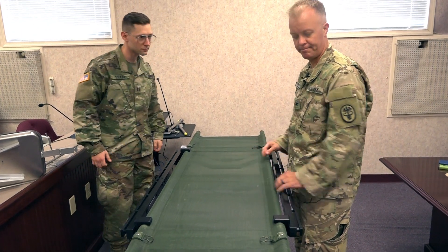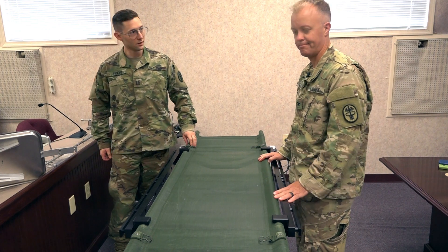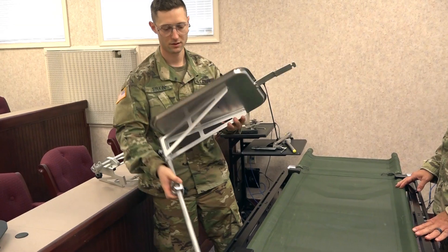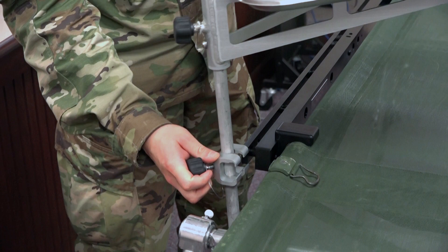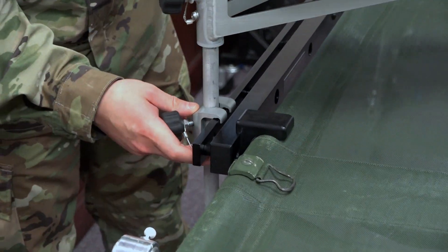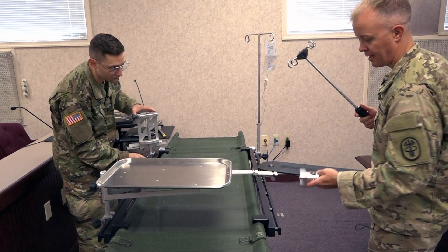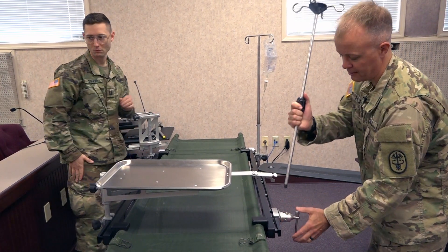Now you have the litter with the rail assembled and you're ready to put the attachments on. This is a Mayo stand — a surgical tray that, as you can see here, can just slide right on. This is a standard attachment for any OR system.